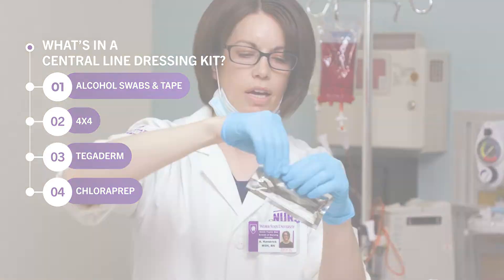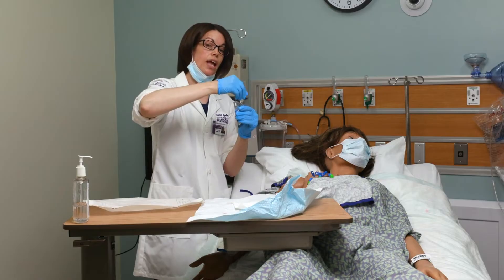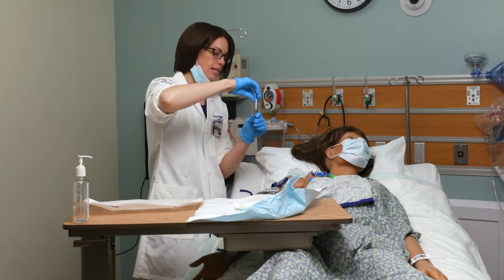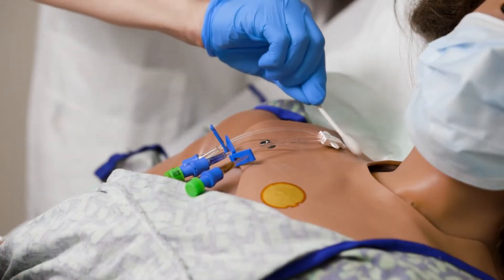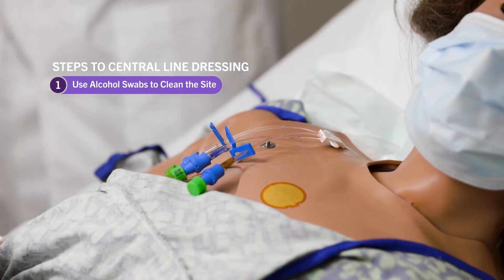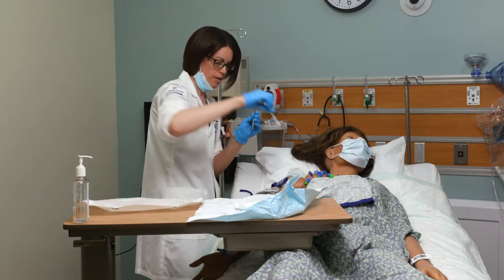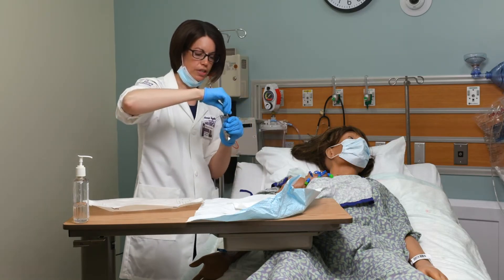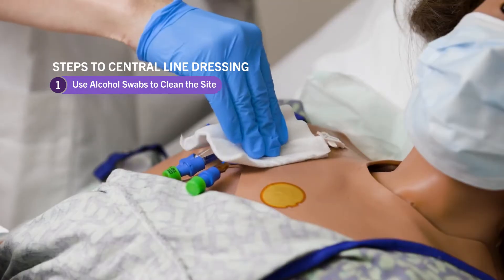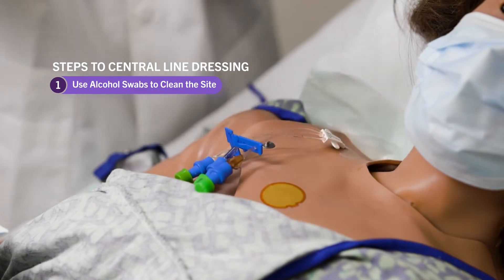First I'm going to take my alcohol swabs and clean the site, making sure I'm scrubbing and cleaning any exudate, debris, or anything on there, focusing on the insertion site and the lumens. I'm scrubbing all around to get everything clean. If I'm having a hard time getting up and around the lumens, I can use my four-by-four to lift up the lumens and swap hands, then use the swab to scrub underneath. You can use all three swabs if needed.